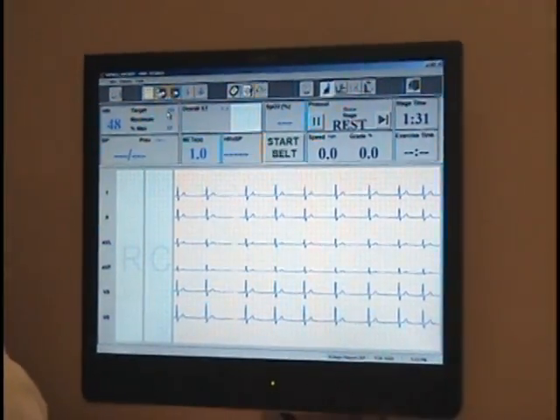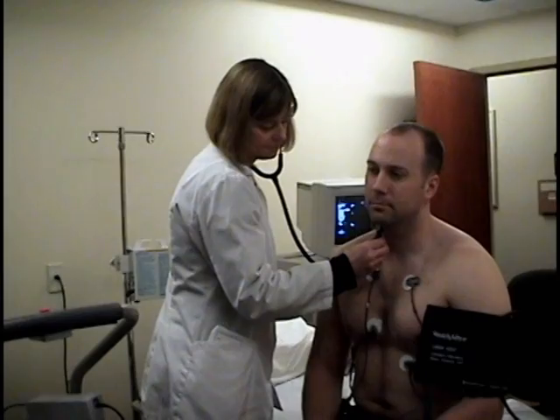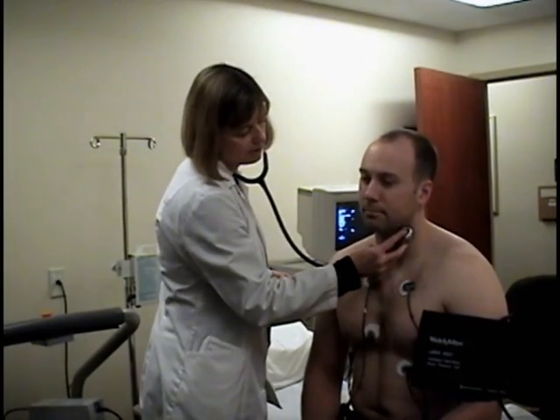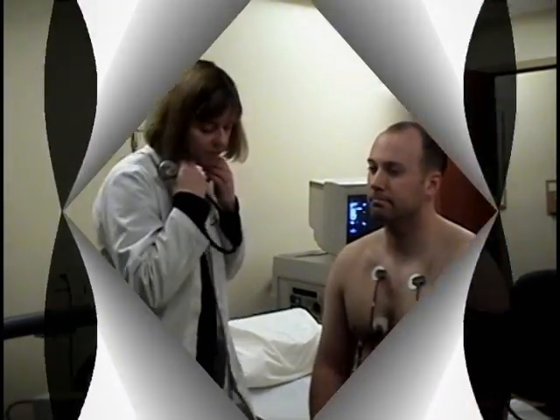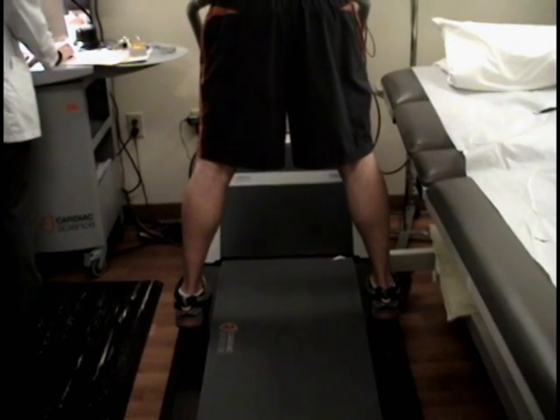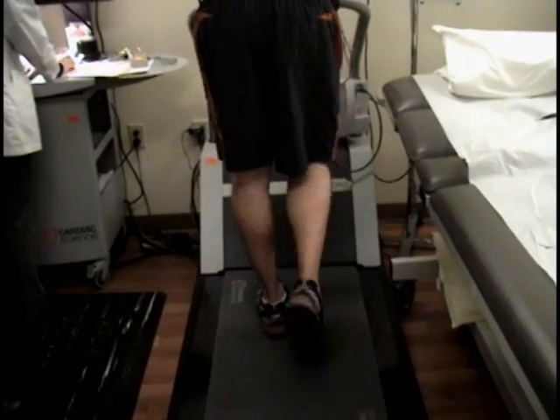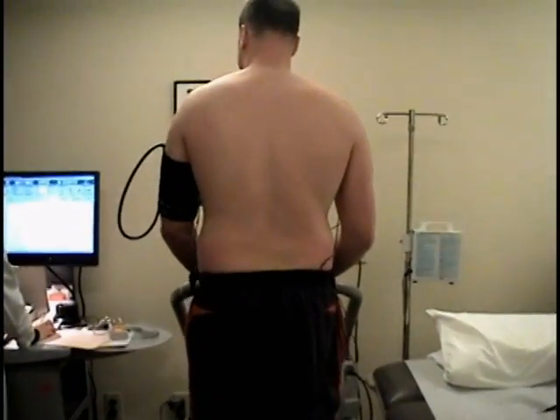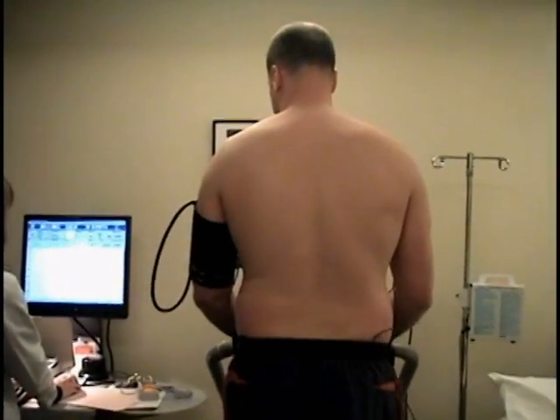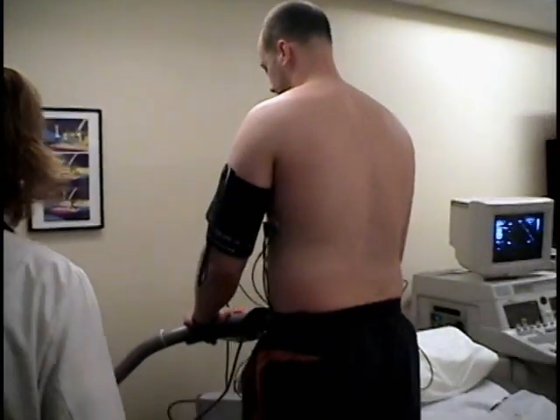Your EKG will continue to be monitored throughout the test. A nurse will then check your vitals and prepare you to begin walking on the treadmill. We do ask that you begin with your feet placed on either side of the treadmill until the belt slowly begins to move. The treadmill will increase in elevation and speed as the test progresses.